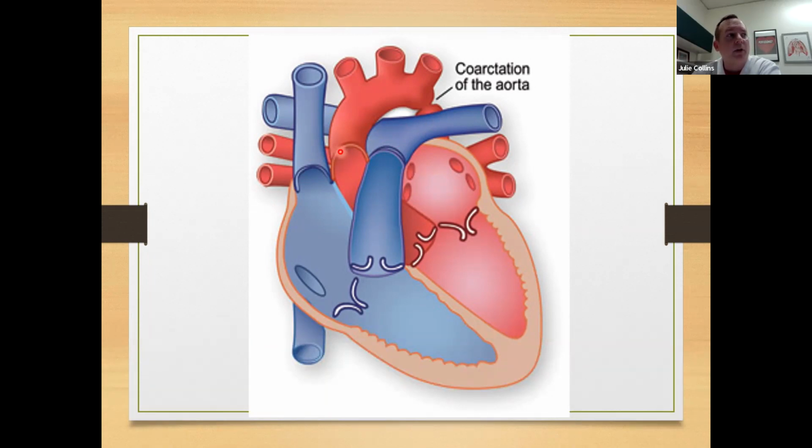Either way, you're using the heart-lung machine to empty the heart enough, because as soon as they put a clamp on here, you're ultimately going to want to control the amount of blood you have going proximal. So proximal pressures, once this clamp goes on, will skyrocket. So you're going to want to make sure you're lowering your flows, taking off enough volume, but still allowing enough volume in the heart to eject properly proximally, and then ultimately you're going to be providing pump flow distal to that coarc.